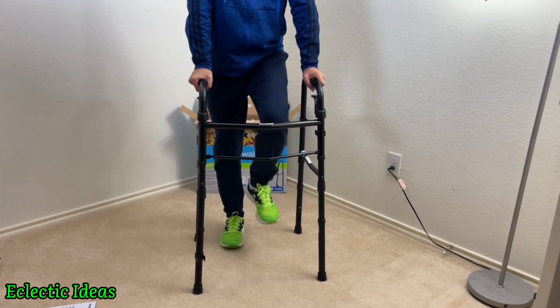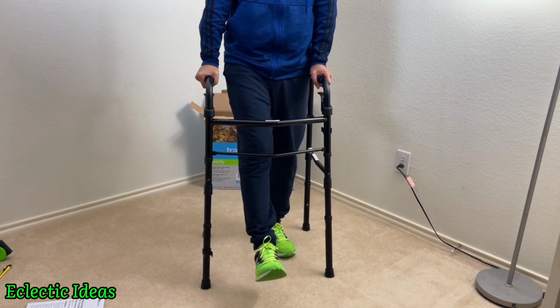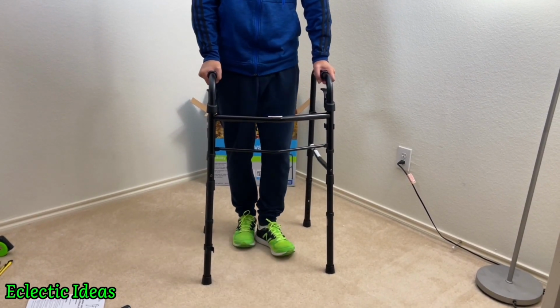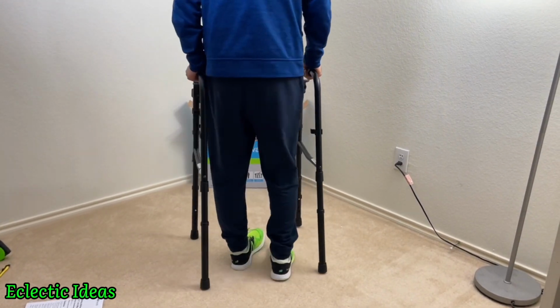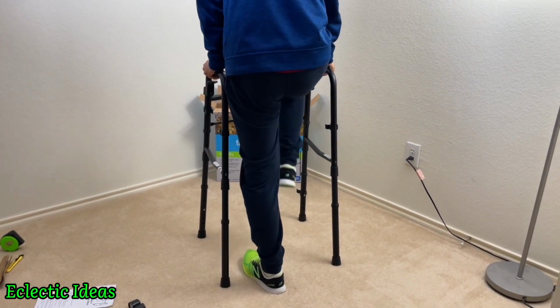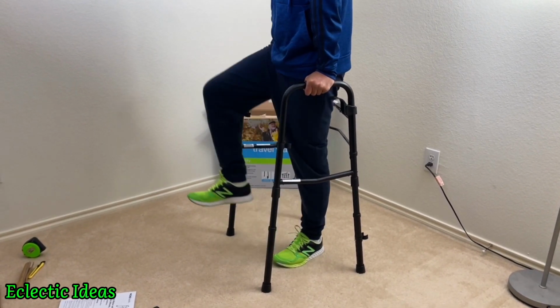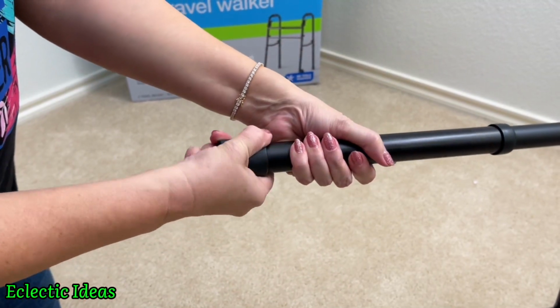And notice how he's doing his physical therapy exercises. The walker could really help you get stronger in rehab. So just follow the advice of your doctors and your physical therapist. Not necessarily our advice because we're just end users and assemblers. So it can be extra helpful for stabilizing you while you get that extra range of motion. It's probably best to do it when somebody else is in the house with you in case you fall, but we want you healthy.